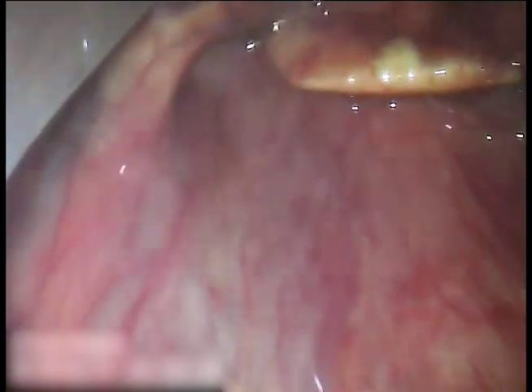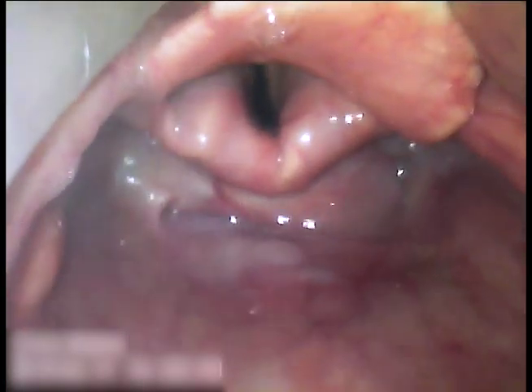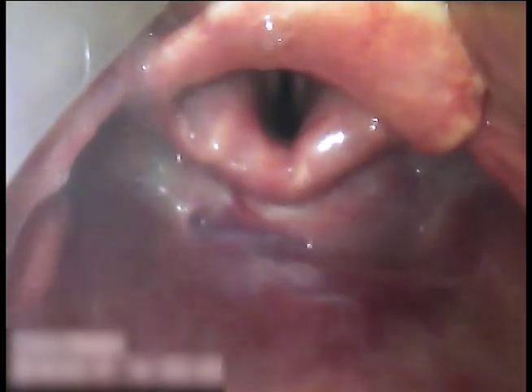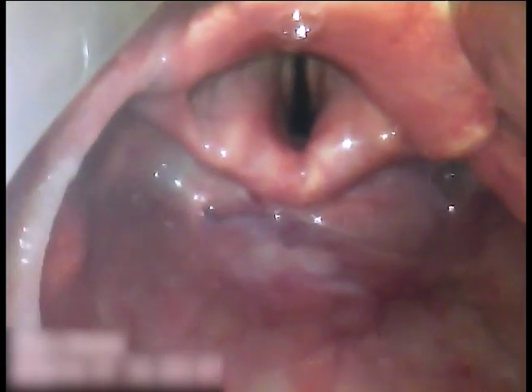In the operating room, he receives an IV induction of anesthesia. He is easy to mask ventilate, and with a GlideScope, his vocal cords are seen to be more relaxed and a small tracheal tube is easily passed.